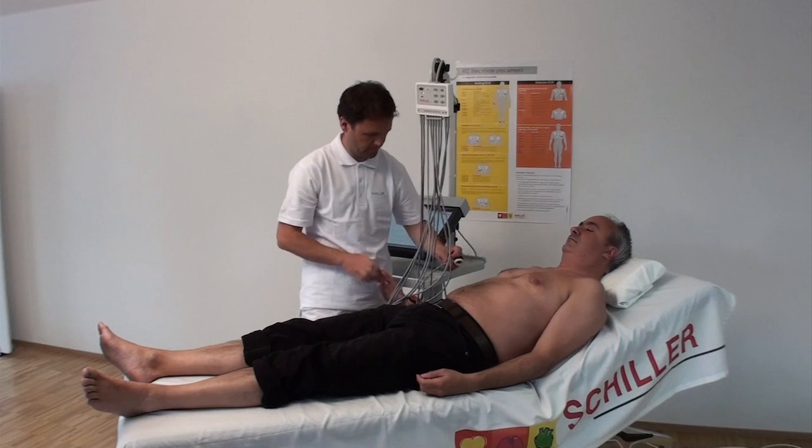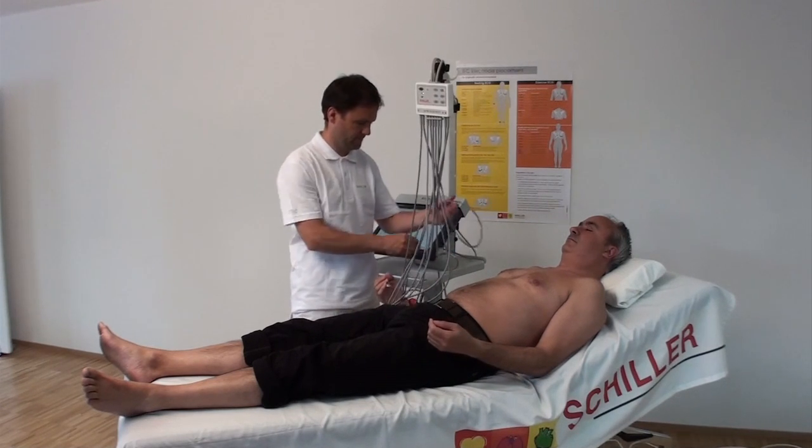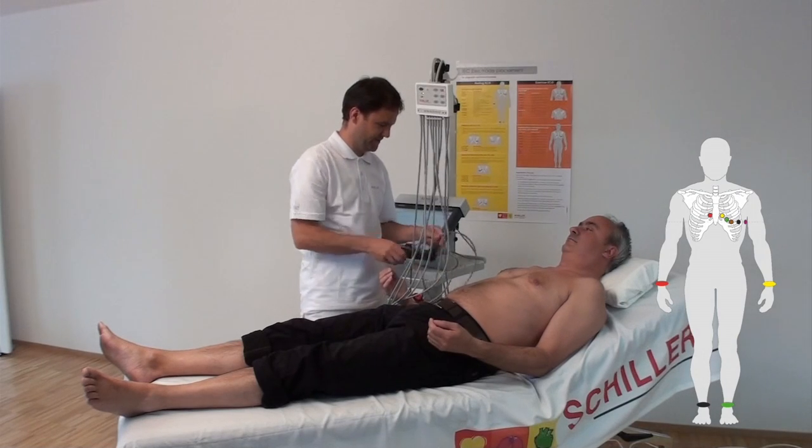Adjust the pressure level if necessary to reduce the risk of suction marks.